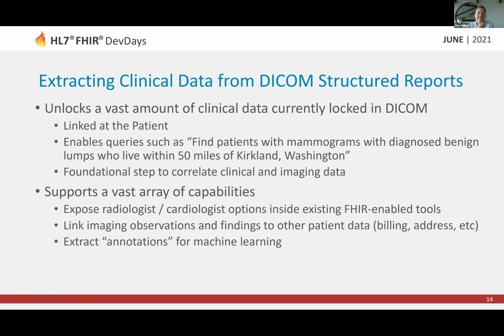It unlocks just a vast amount of clinical data. Worldwide, the majority of DICOM studies have radiologists who have looked at this data and made findings, and it remains locked inside this system. It is nowhere near FHIR. So we're building this beautiful FHIR ecosystem that interacts broadly with all of these amazing tools. And you can find observations and diagnostic reports and findings and all of these things in FHIR, except for all of the stuff that the radiologists have worked on.